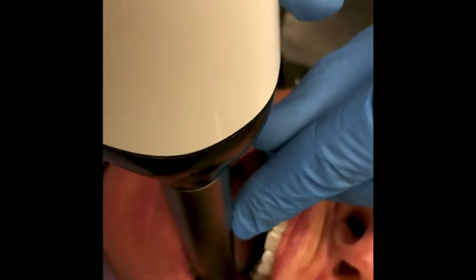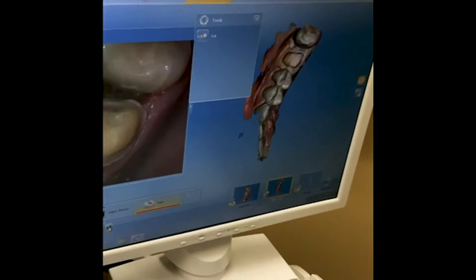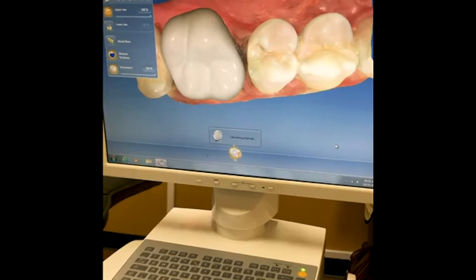This patient had a cracked tooth and required a crown. So instead of taking an impression of the tooth, we now use a digital camera and we make a digital model of the tooth instead of a stone model. We use that digital model to design a digital crown.